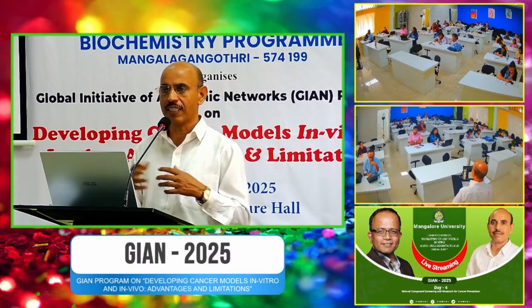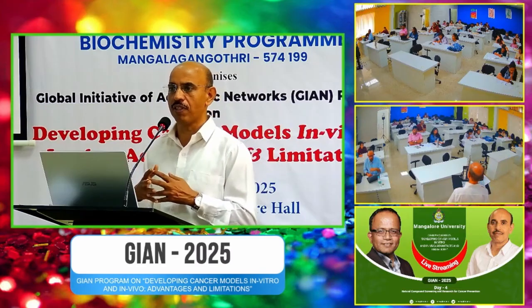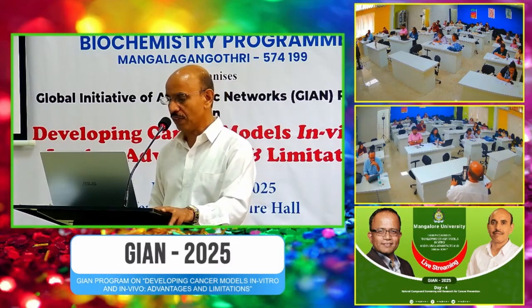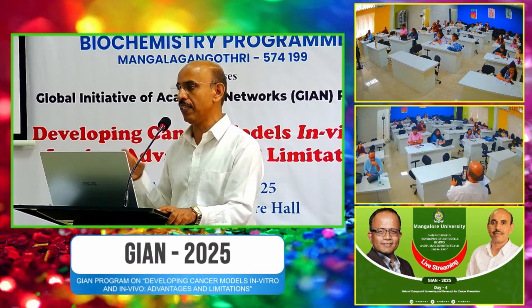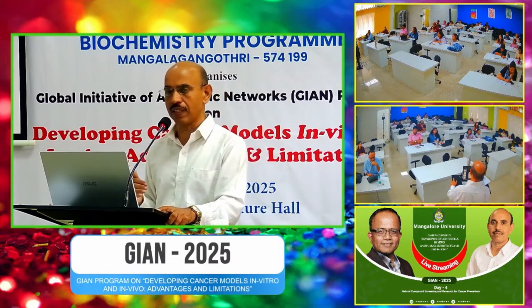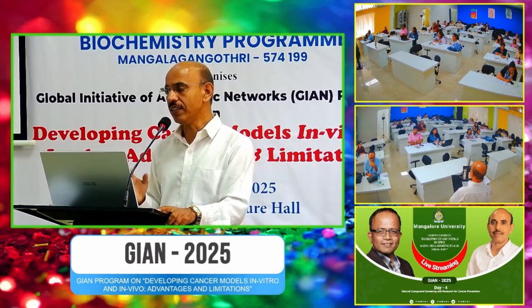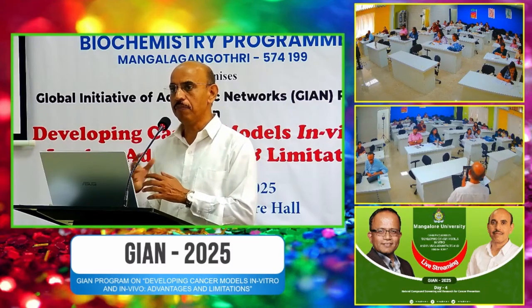And there you need the water bath to maintain uniform temperature, and autoclaves, because if you have to sterilize anything you need the autoclaves, and refrigerators and freezers. There are different kinds of refrigerators maintained at 4 degrees Celsius, some maintained at minus 20, and certain freezers maintained at minus 80. All these are used for storing different chemicals or solutions based on necessity or conditions.